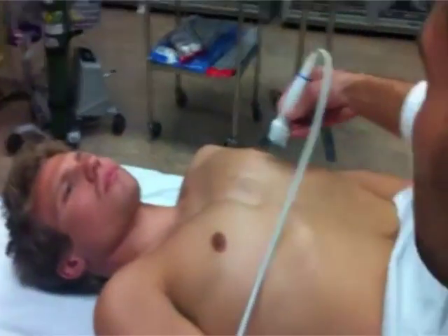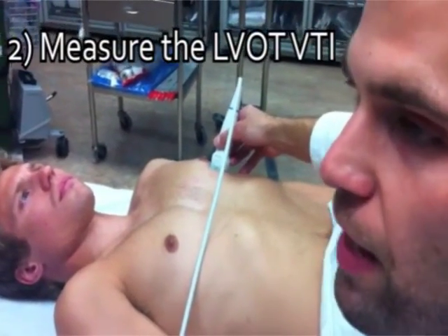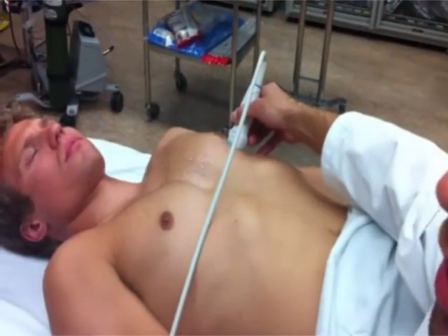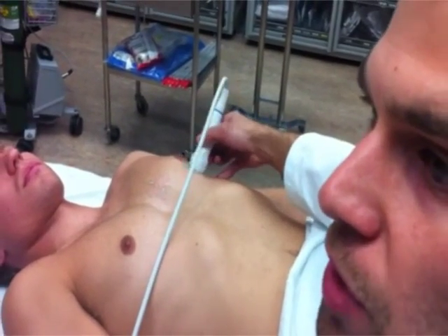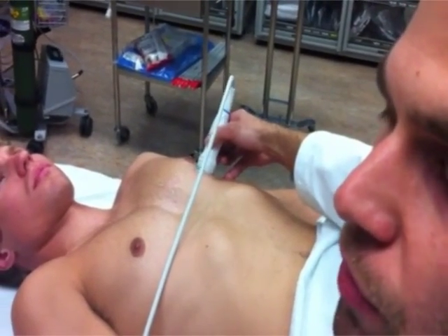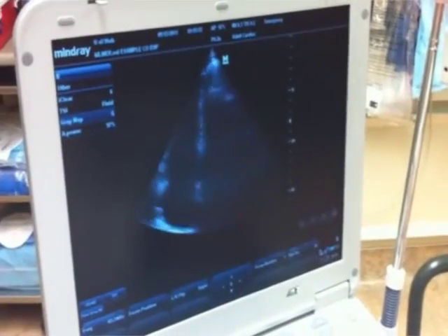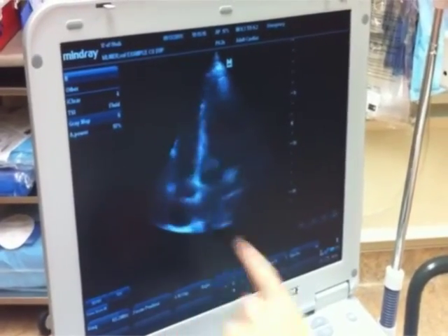For the next view, I'm going to need the patient's LVOT VTI. To get that, I'm going to find my apical four-chamber view. I've started just under the patient's nipple, which is a good place to start, with the probe marker pointed towards the patient's axilla. I'm going to try to find that four-chamber view. Here on the screen we've got sort of the four-chamber view. This is the right ventricle, the right atrium, and the left atrium.